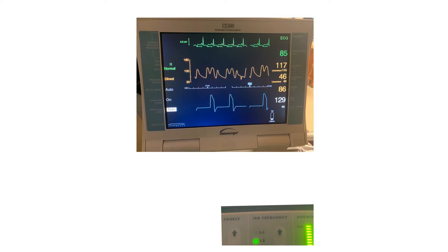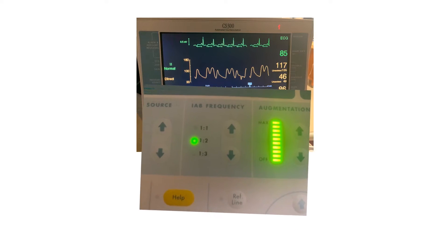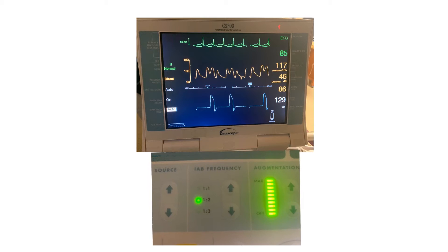This is the intra-aortic balloon pump screen — the monitor for the machine. There is also a control board for the intra-aortic balloon pump right here. It's usually set up like this. I should have taken a full picture of the whole machine, but anyway, here is the trigger source.